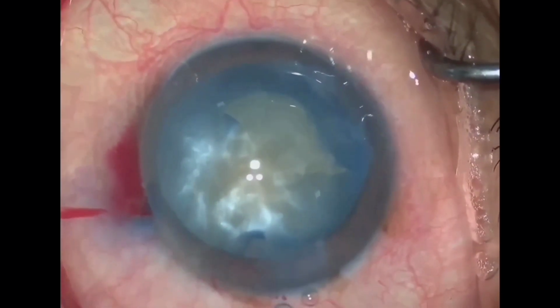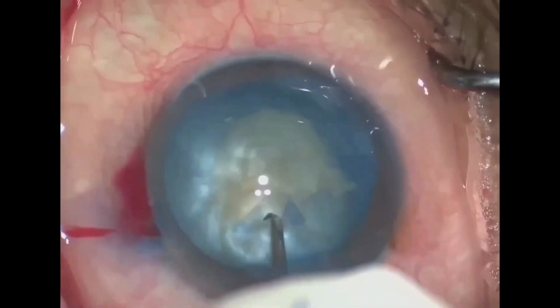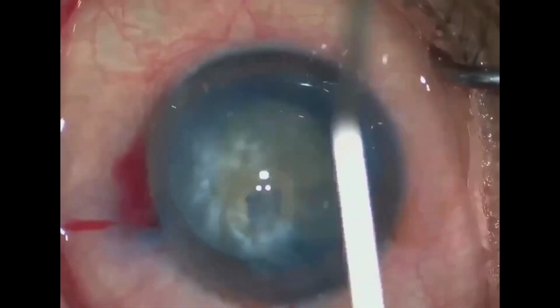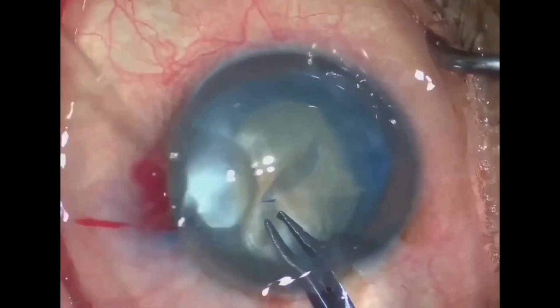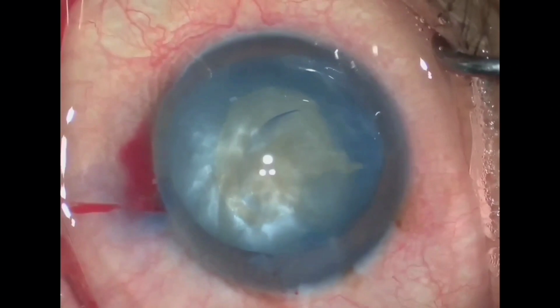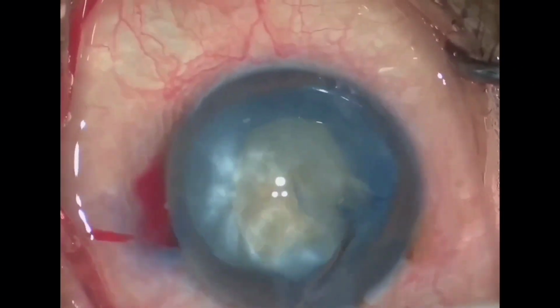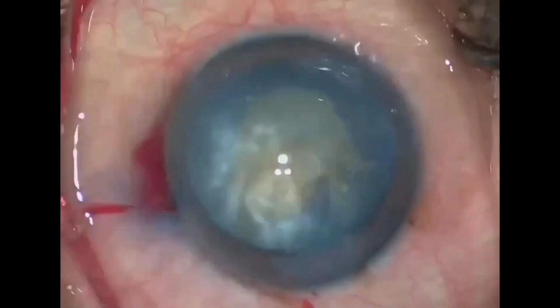Viscoelastic is again injected and the rhexis is continued with cystitome. Viscoelastic is again injected and rhexis is completed. As we can see, maneuvering inside the anterior chamber became easy after passive decompression by the sclerotomy port.